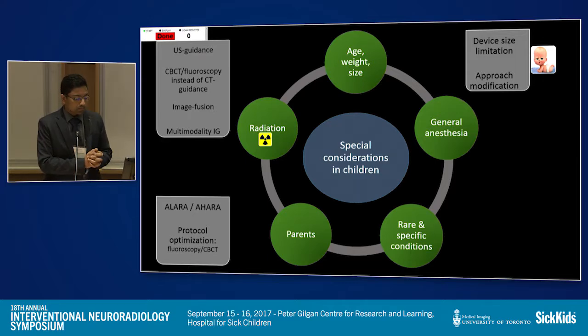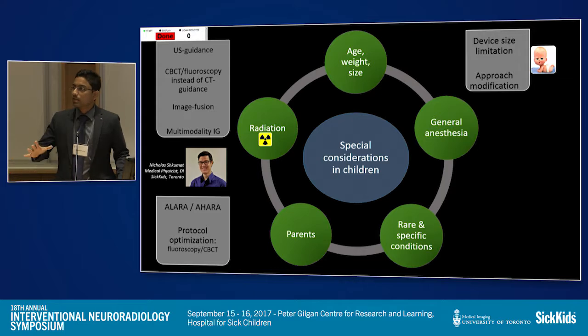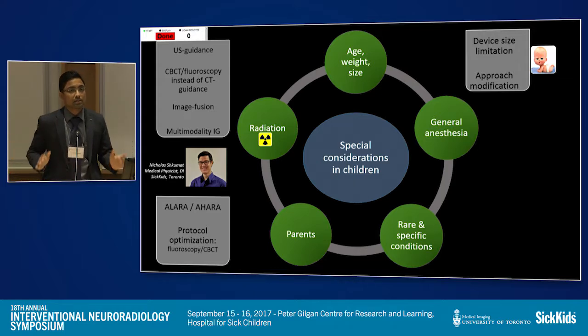We also collaborate with our medical physicist, Nick Shkumat, seen here in the inlay, to ensure that all our X-ray doses, especially cone beam, are optimized. For example, the cone beam CT doses that we are currently using are 1/10 of the factory standards. But also to make sure that in these procedures, the benefit to risk ratio remains as high as can be reasonably achieved.